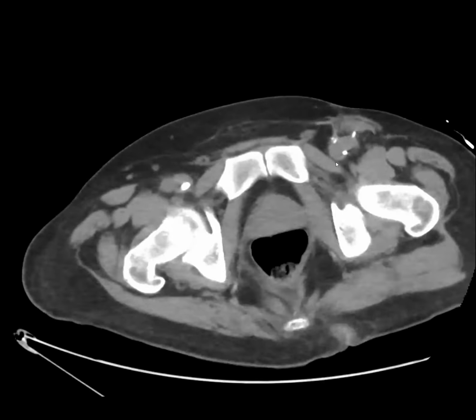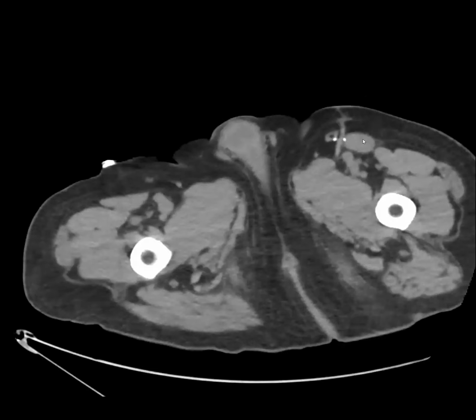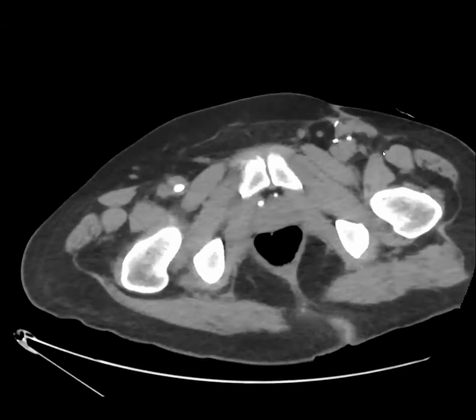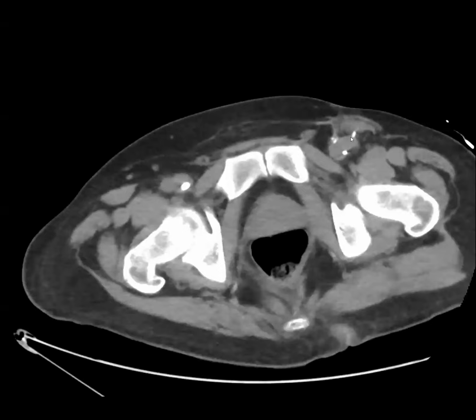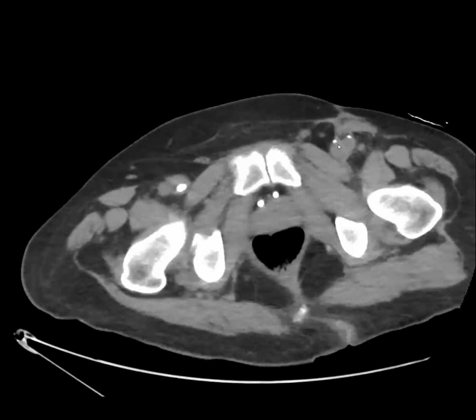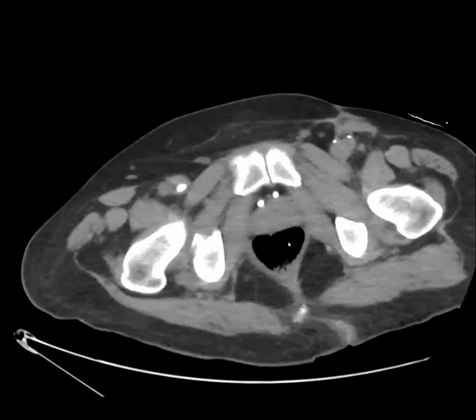They can use it for other parts of the body, but they can also do a connected flap where part of it is normally connected and they just flip part of it up. They disconnect it and flip part of it up and over to protect these vessels and promote healing. So this is just a Gracilis flap that was used in this situation. Don't confuse it for a hematoma or anything else.